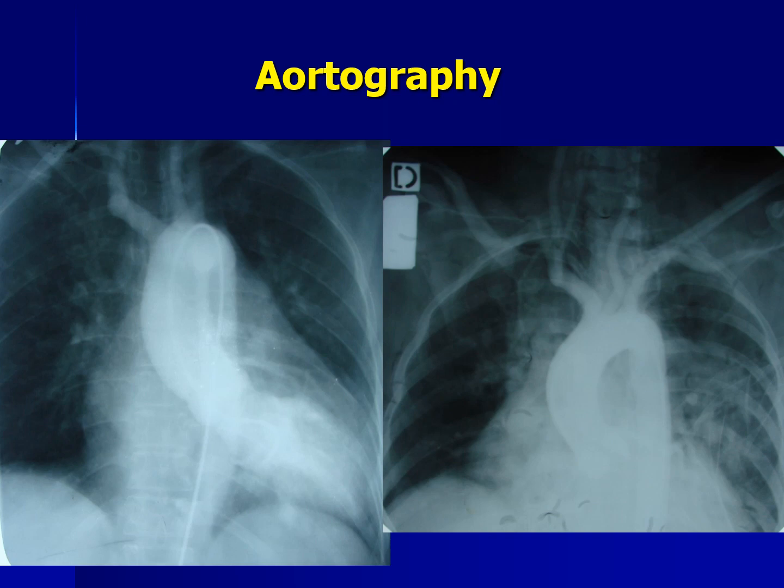This X-ray shows us aortography. The contrast agent is in the aorta.